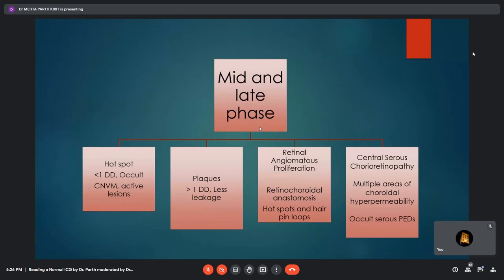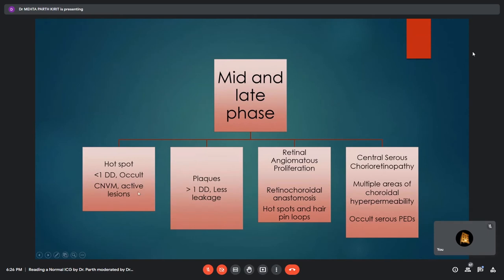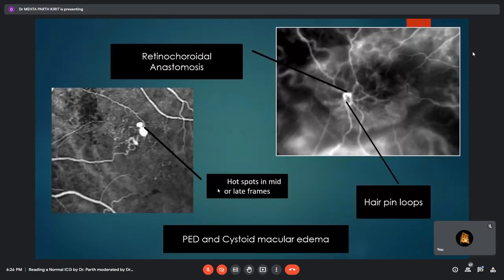In the mid and late phases, particular importance is given to hot spots and plaques in cases of CNVM. Hot spots are less than one disc diameter and represent active lesions. Plaques are more than one disc diameter and represent areas of lesser leakage.